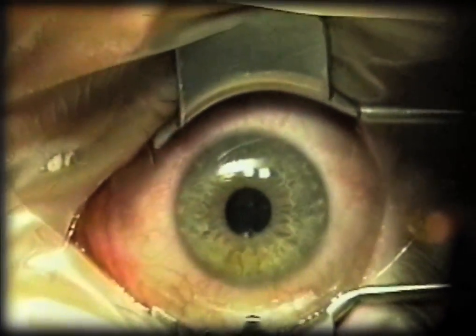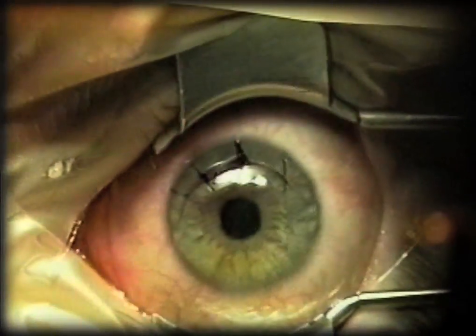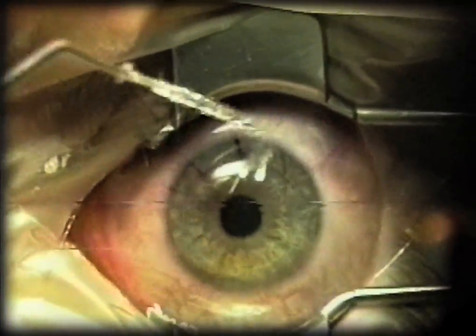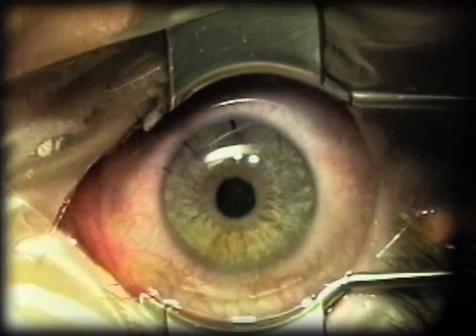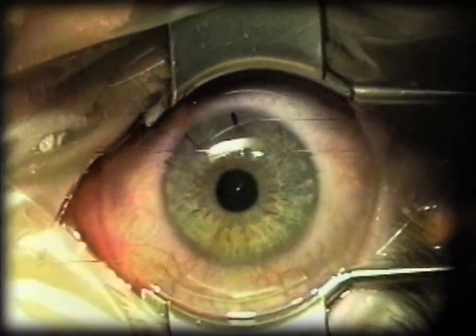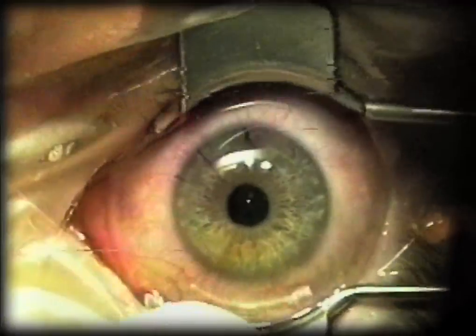In most cases I don't do 360 degree ink marks — they're not necessary. I have confidence that I'm going to have a good hinge, so I just ink a small amount of the marker in the periphery. But if you have any issue about centration or possible free cap, then inking 360 degrees is nice because you know exactly where the ring is going to sit relative to the pupil.